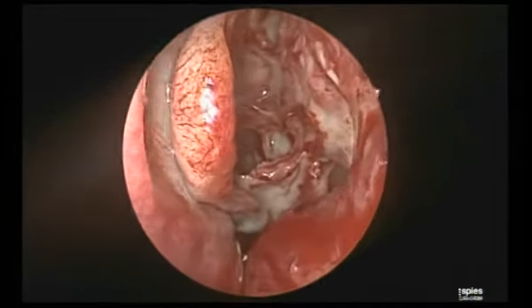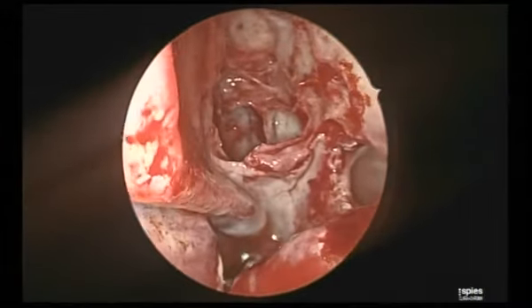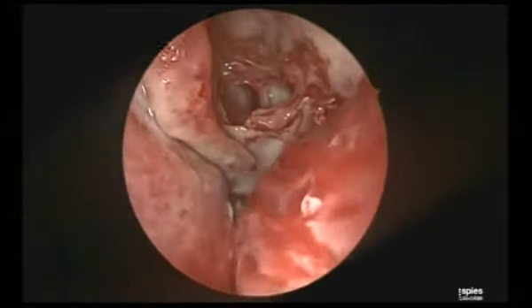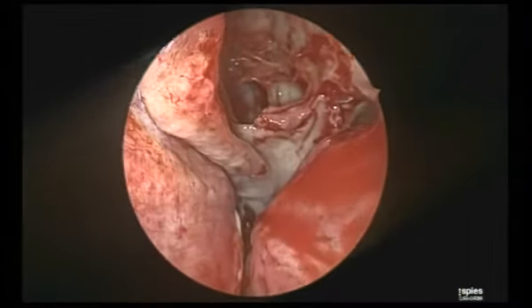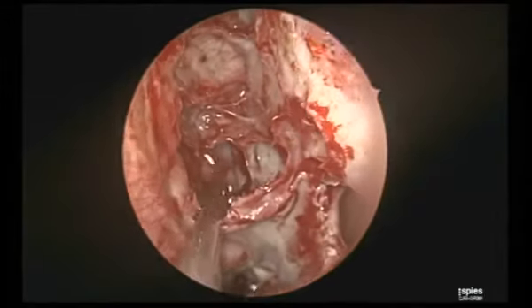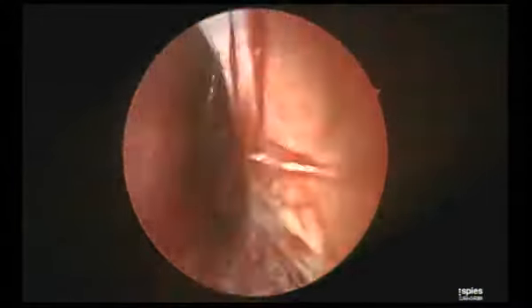And this is the access. The reason for this surgery to me now more and more is to give access to the topical steroid. Fantastic. This is an immune complex disease which requires steroid. I can't give oral steroid for long. So my strategy is to make the patient use the topical steroid, so that penetration cannot happen unless you give this kind of access. Okay? Yeah. Fantastic. So now we'll move on to the other side.